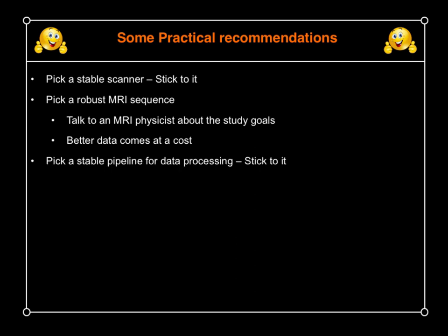You want to pick a stable pipeline for data processing. There are many that are around. FreeSurfer is now probably the most stable software for surface-based analysis. For voxel-based morphometry style of analysis, you have FSL and SPM. Many of the issues have been sorted out with these packages.